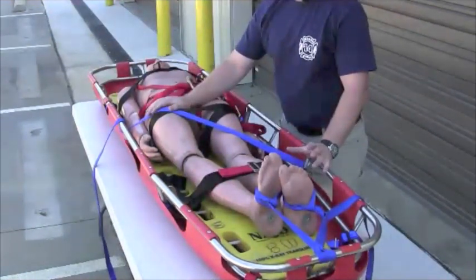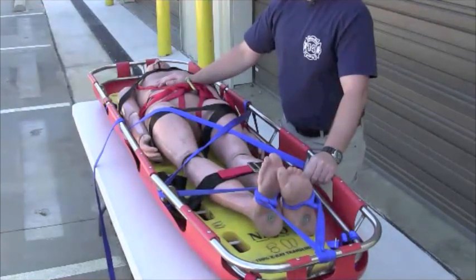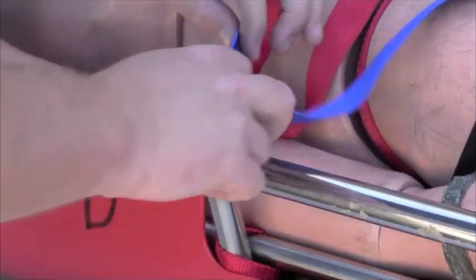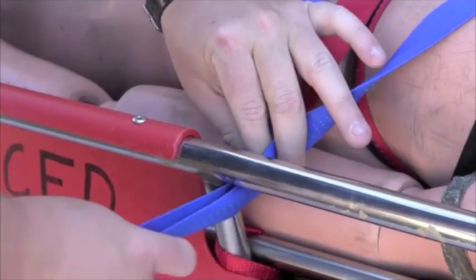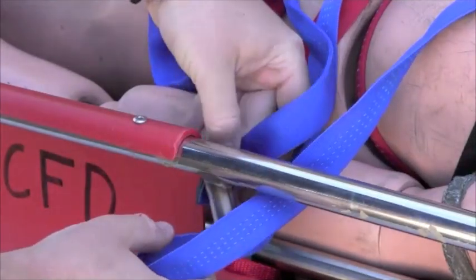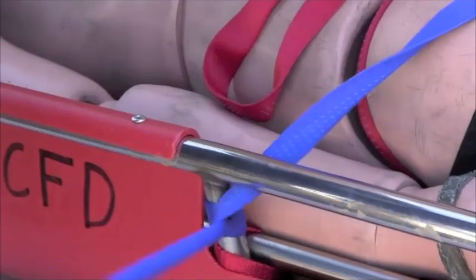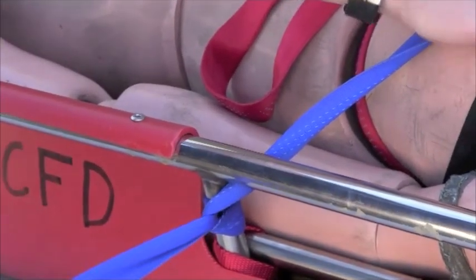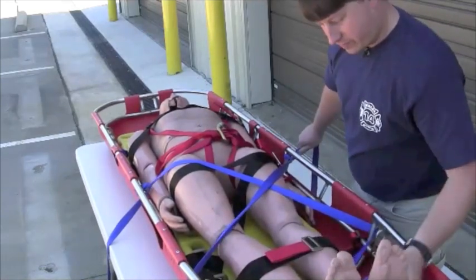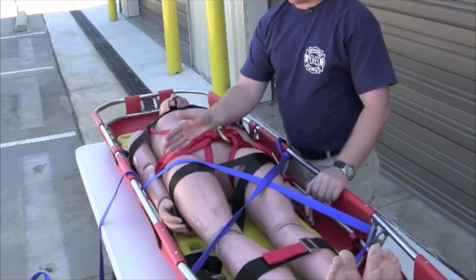I've done one side of the diagonal lashing, now I'll do the other side. To get the slack out of these straps and get it tensioned really well, we can make a girth hitch on each side and use it as a ratchet to take up the slack out of all this webbing. To make the girth hitch, take a bite of webbing and place it on the foot side of a vertical post, then bring the tail of the webbing around the other side of the vertical post and through that bite. Now we've made a girth hitch that we can ratchet to get all of the slack out and tie this patient in securely. We should do this ratchet somewhere around the pelvic area, right around the hips.